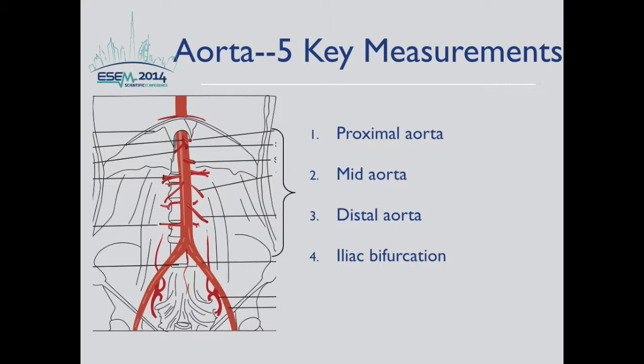And finally, a longitudinal view of the abdominal aorta. So remember, these are the 5 key elements where you should examine and measure the abdominal aorta.